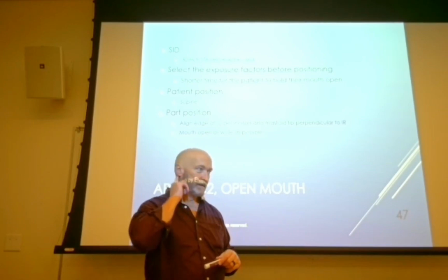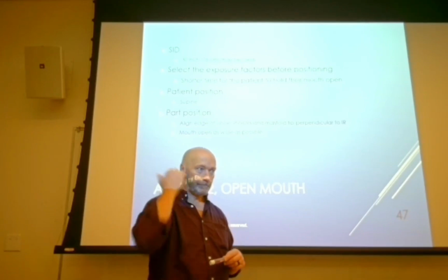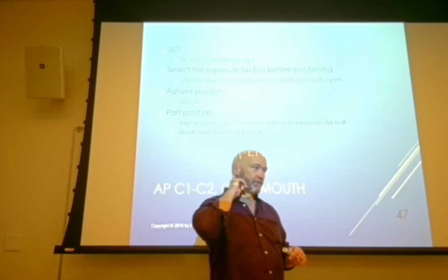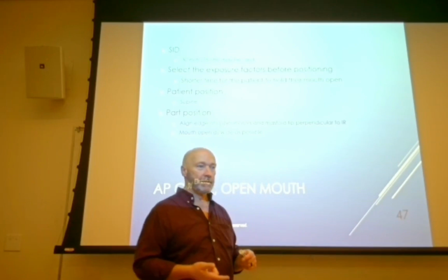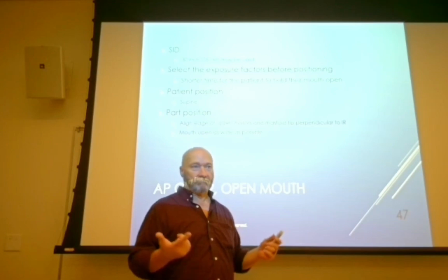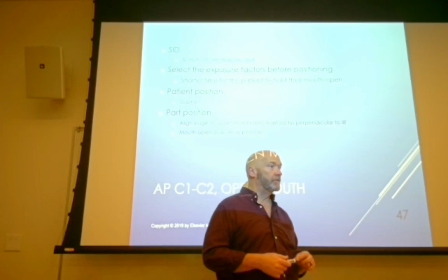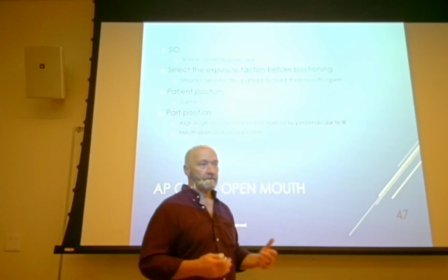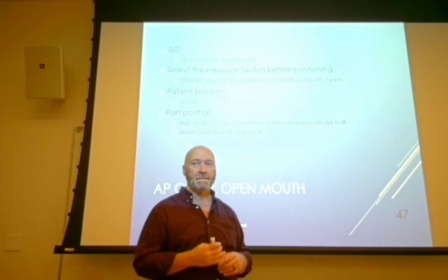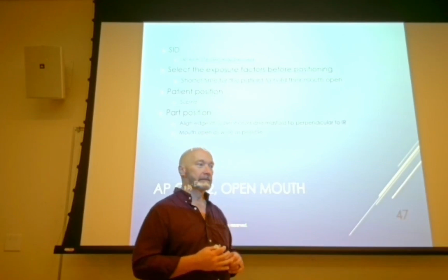How are you going to find this with a patient that's got a collar up to here? You're not. You might try to feel down in there and feel of it, but as soon as you stick your finger inside of that patient's collar, what are they going to do? They're going to start moving around, right? So is that good for a patient with a potentially broken neck? The answer is no, it's not. So just get in the habit of using the acanthomeatal line unless you have somebody with some really bad teeth or no teeth at all. And you'll run into both of those in East Texas, right?